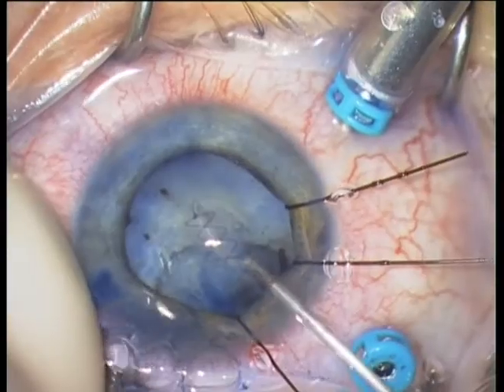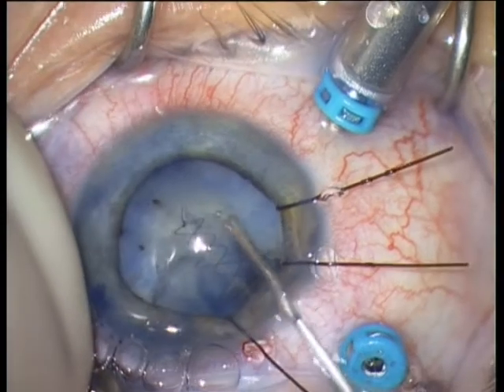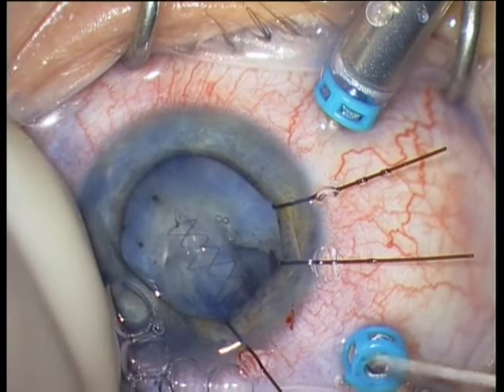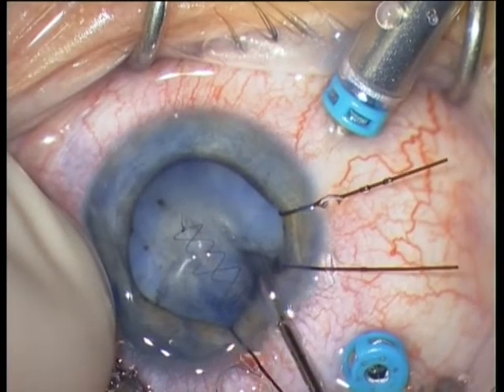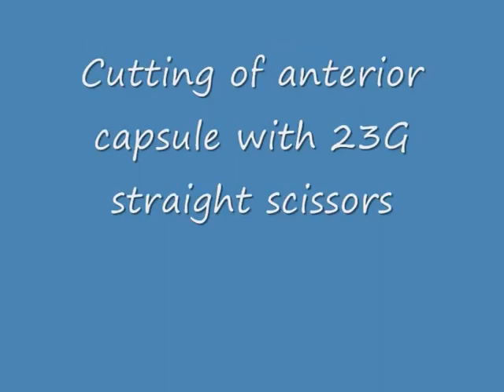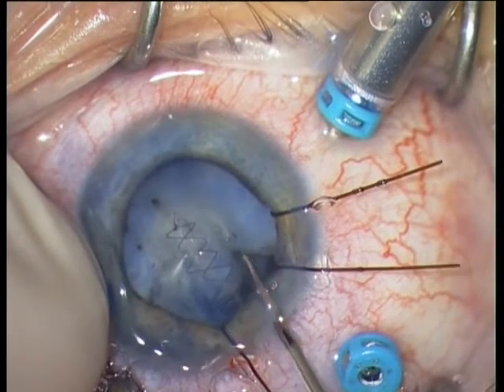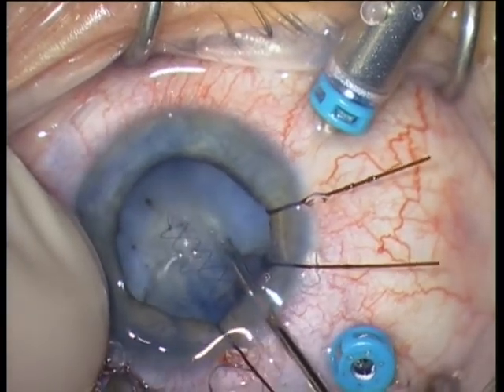The capsulorrhexis is of course difficult because there is a lot of scarring from the trauma and the capsular defect. But always try to perform a rhexis as good as possible and always use your intravitreal instrumentation. I am using here a 23 gauge straight scissors from Dork to cut the scar tissue at the anterior capsule. And now I am using an Eckert end-grasping forceps to perform the capsulorrhexis.